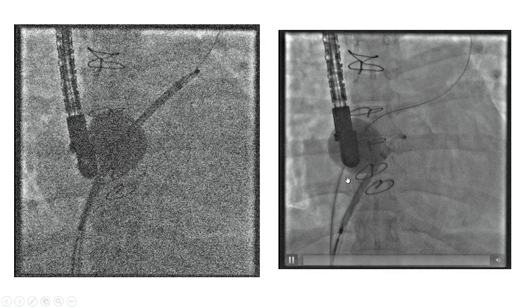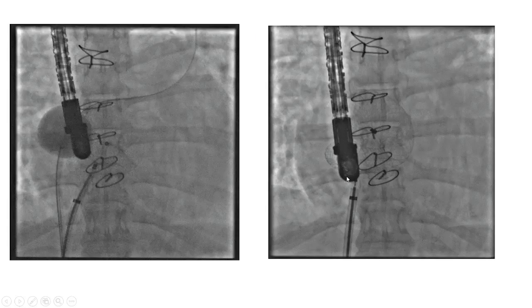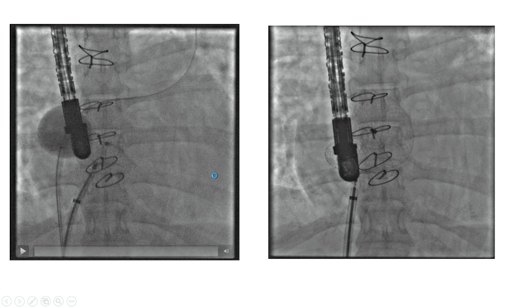The Amplatzor Equalizer balloon helped us to position the device. We gradually deflated the equalizer balloon, and then the device is in good position. This is how the equalizer balloon helps to keep the position of the device — it is pushed into the RA when the device is in position.